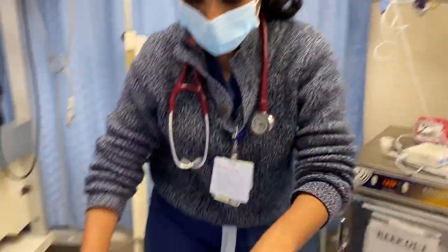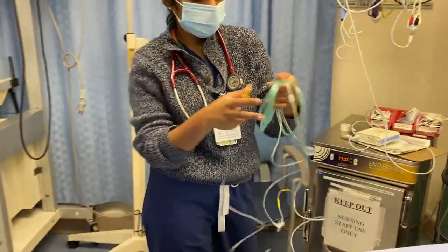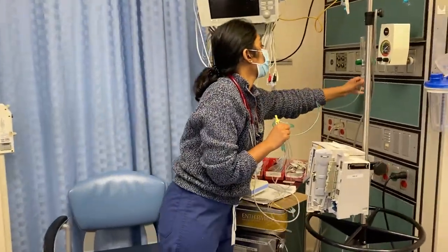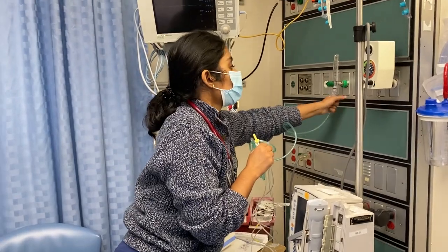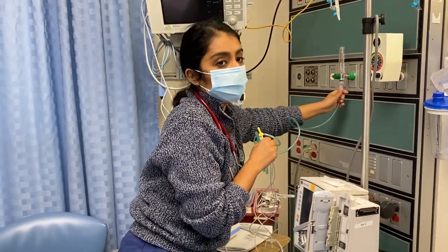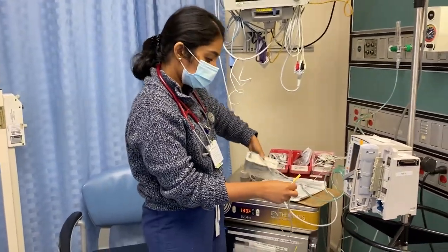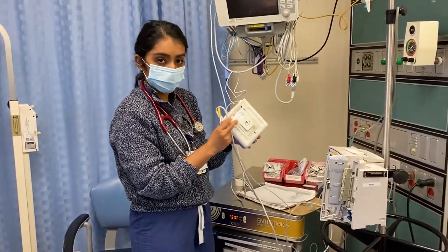And then we have the tubing for the end tidal CO2. This goes into the wall for the oxygen. So you don't have to turn the oxygen on. You do not have to turn the oxygen on. Many times we prefer not to. And then the end tidal CO2 is a little bit more sensitive as far as picking up changes.